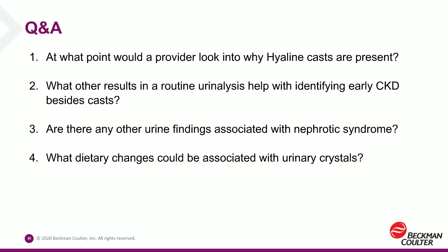Excellent. The last question we have today, so Dr. Ness, in my years in the laboratory, the crystal I probably saw most often was calcium oxalate. And I know those patients didn't have ethylene glycol poisoning. So what dietary changes could possibly be associated with urinary crystals such as calcium oxalate?